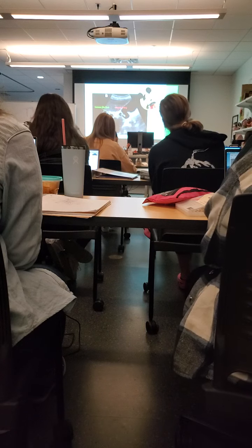There's your Mickey Mouse. This is a transverse image. See how much bigger that portal vein is, you guys? It's huge. Is that a regular size portal? Oh yeah. It should literally look like a Mickey Mouse head. When you find that, you're like, I'm getting good at scanning. I just got the portal triad.